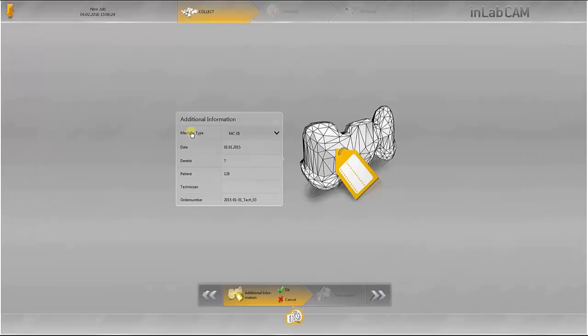After selecting the relevant file, you receive an information overview for the design which you can confirm by pressing OK.